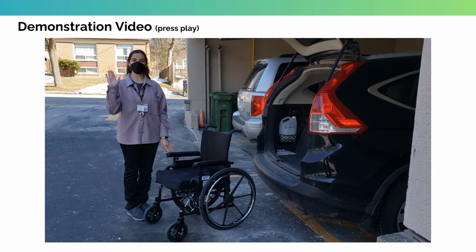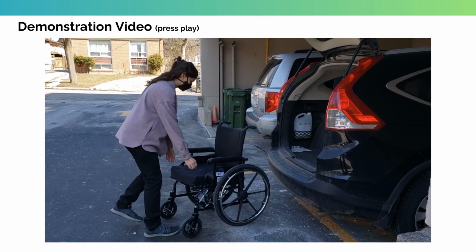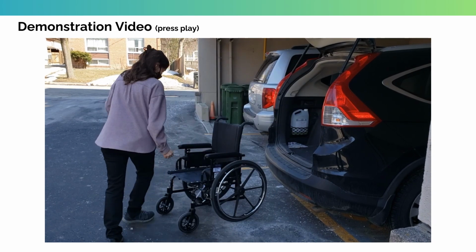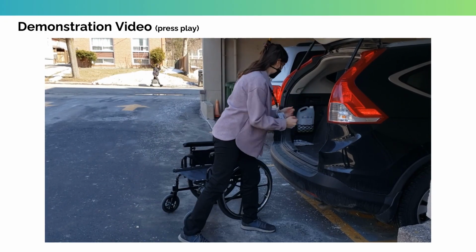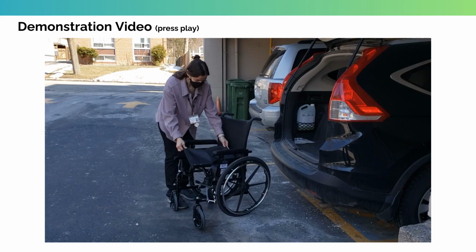Once your client is safely in the car, you'll need to place their wheelchair in the trunk. Let's look at how to do this more ergonomically. Every wheelchair is different, but generally you'll start by removing the cushion, then the footrests, and any other accessories before you can collapse the wheelchair.